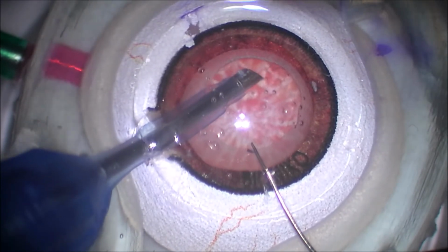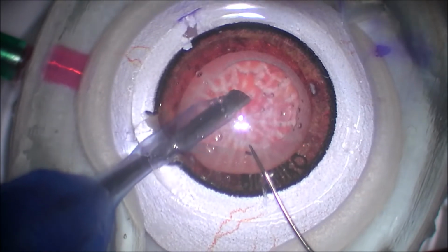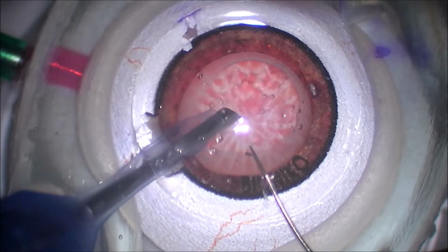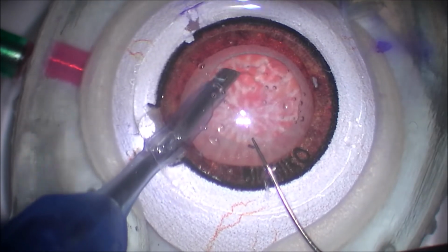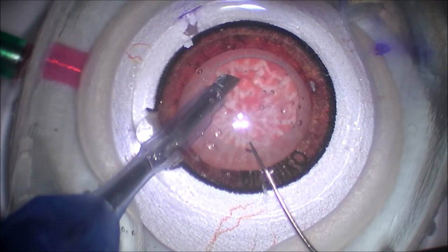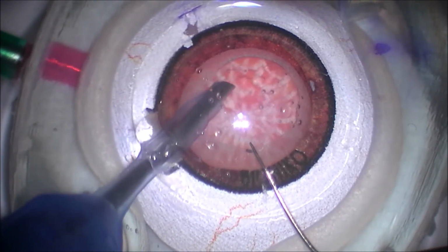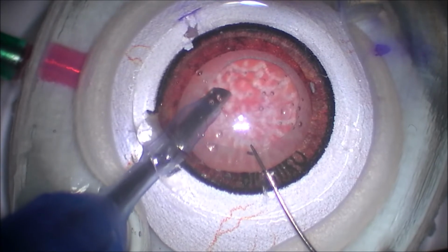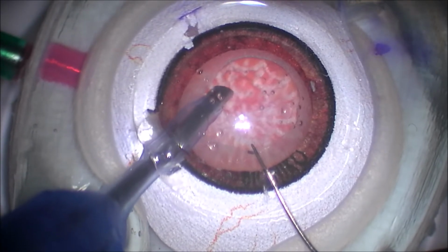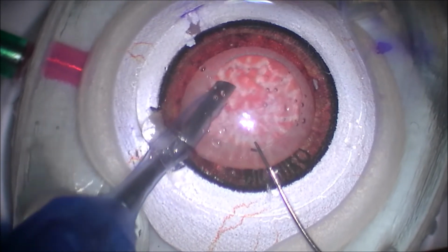You can see here she was pretty good about turning the bevel towards the left. So that's another pearl. If you're trying to get purchase and you try to grab pieces, you want to turn the bevel towards where you're trying to get purchase. And so if the piece is on the right side, you can turn the bevel towards the right, so you can get good suction and purchase of the lens piece, which you can then increase vacuum and pull the pieces out. If it's on the left side, it's the same thing. You want to turn the bevel to the left.